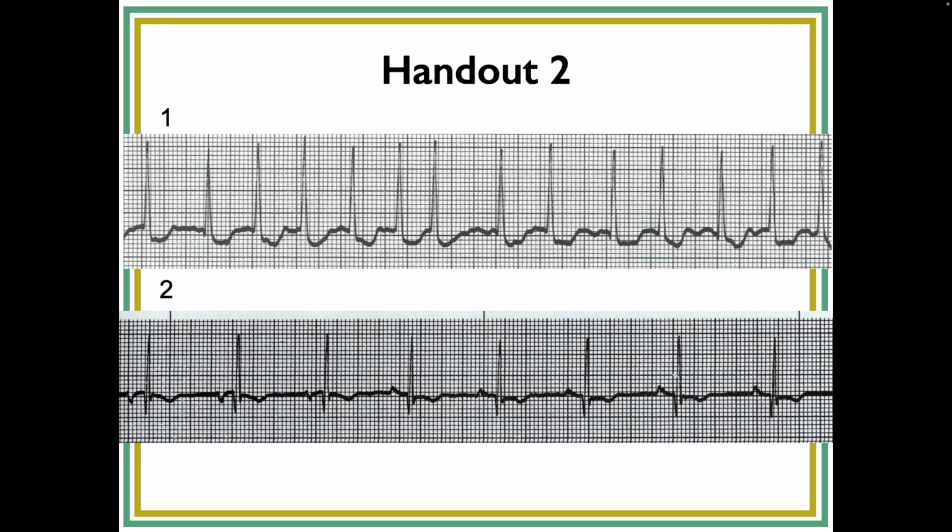Okay, so we got, question for you. Let's start with step 1. You're going to get there, but you don't want to skip those steps. It looks pretty regular to me, and you marched it out. The rate was about 70 using the boxes. I agree. By all means, use the boxes, but in this case we even have the marks for a change: 10, 20, 30, 40, 50, 60, 70. Yeah, 70, 75, good. Now you get to look at the P waves.